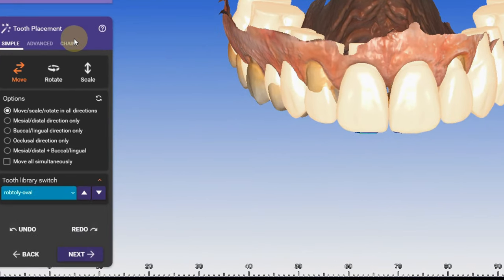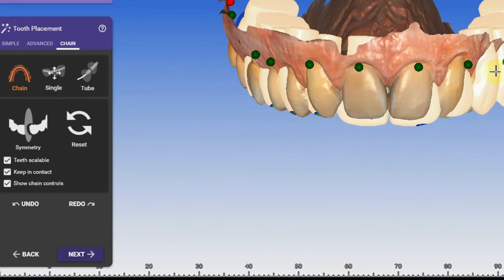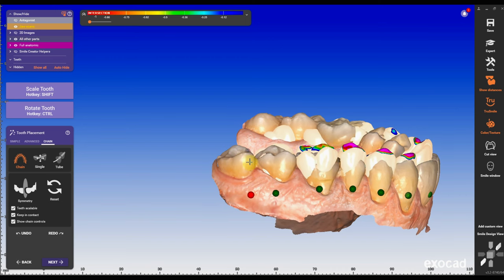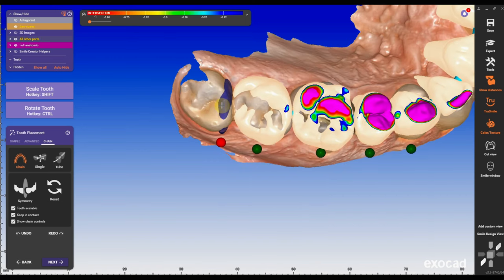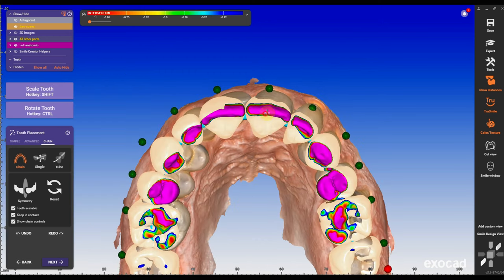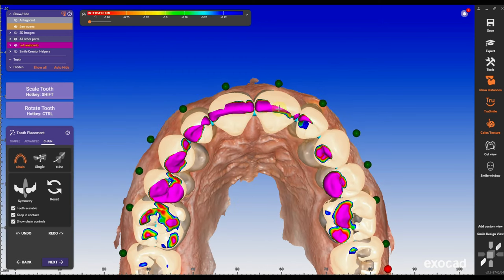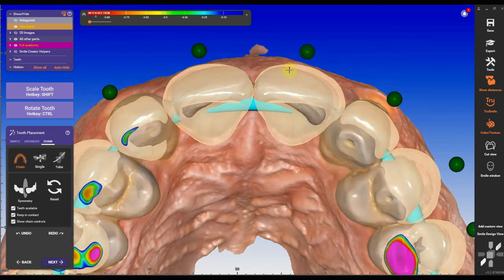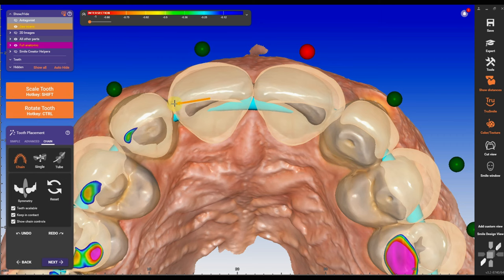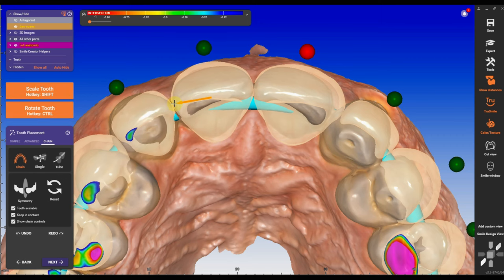Chain mode is probably my favorite tool in XOK. I can position full arch cases very quickly. In this case, I'm gonna add the anteriors first and make them in the dimension of the anteriors I already have.